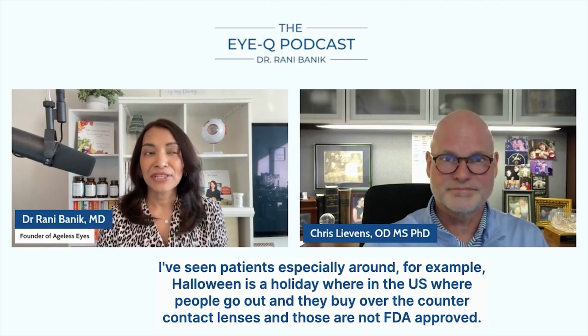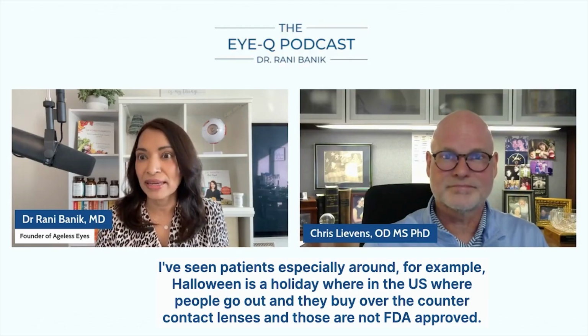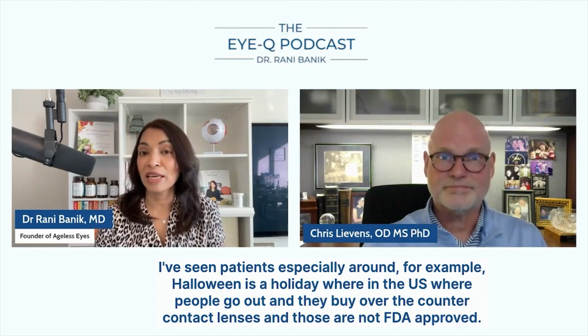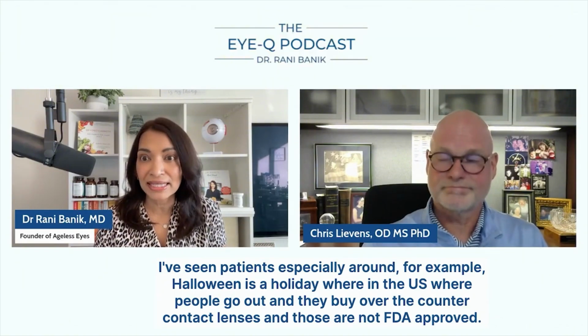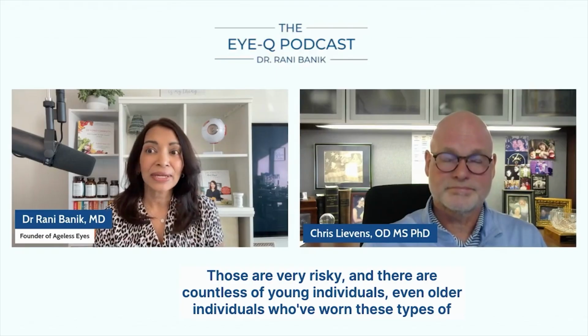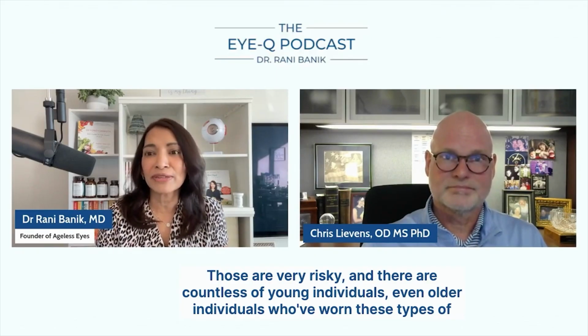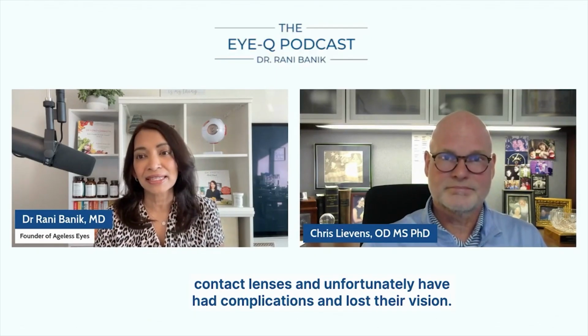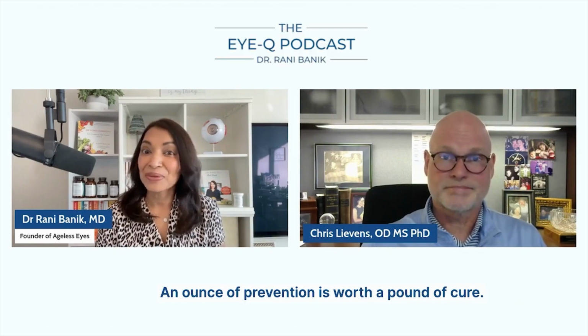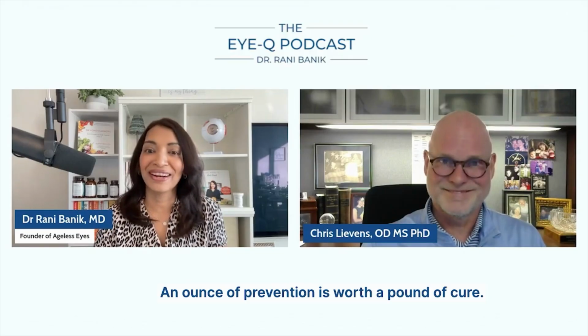I've seen patients, especially around, for example, Halloween, a holiday in the US where people go out and buy over-the-counter contact lenses. And those are not FDA approved. Those are very risky. There are countless young individuals, even older individuals, who've worn these types of contact lenses and unfortunately have had complications and lost their vision. So an ounce of prevention is worth a pound of cure.